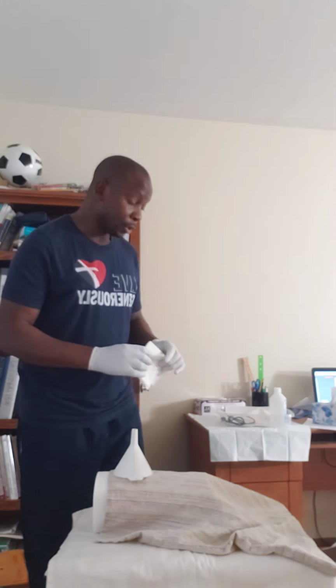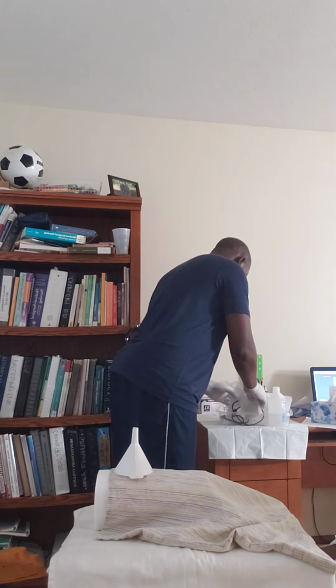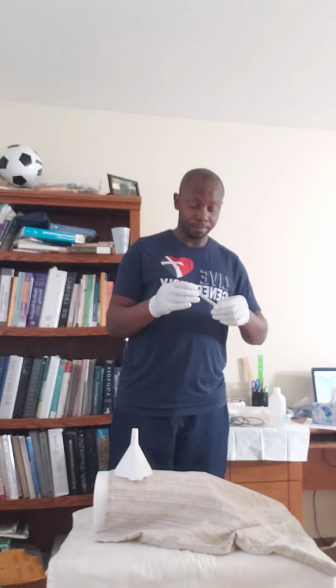So it's good to mix. I'm going to mix half normal saline and half hydrogen peroxide together. Okay. And remember now, my cannula is in the water. So what I'm doing, I'm done. This is my cannula. But when I'm done with these things, I'm going to throw them away.